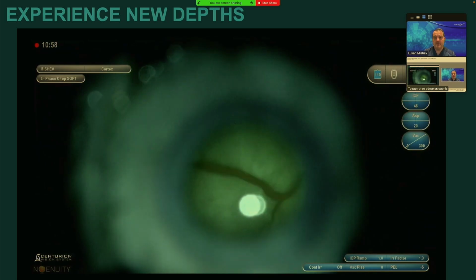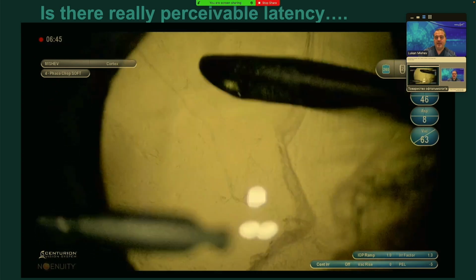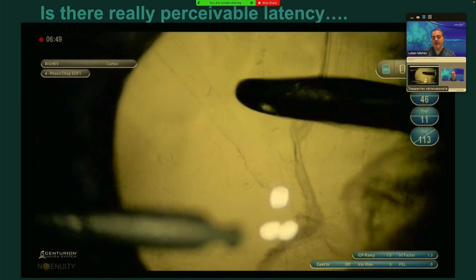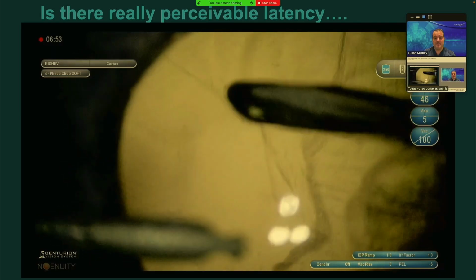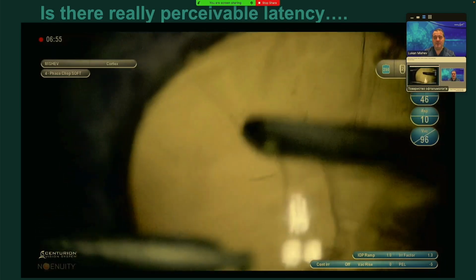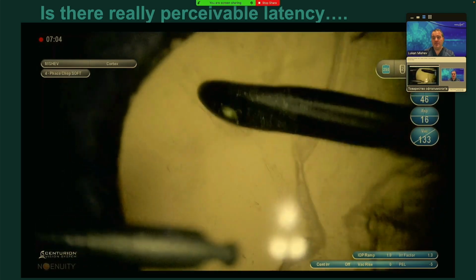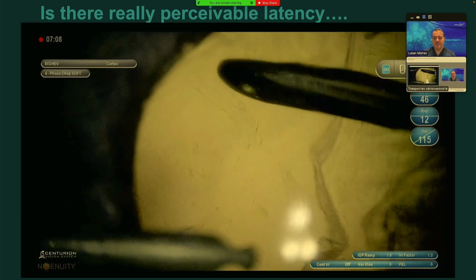So it's impressive. Also, in the past, there were some concerns about latency, and you can see how I play with the capsule here, and I wouldn't allow myself to if there was latency. Otherwise, I would create a PCR. So the issue with latency, especially with the Ingenuity, doesn't exist anymore, at least in my opinion.